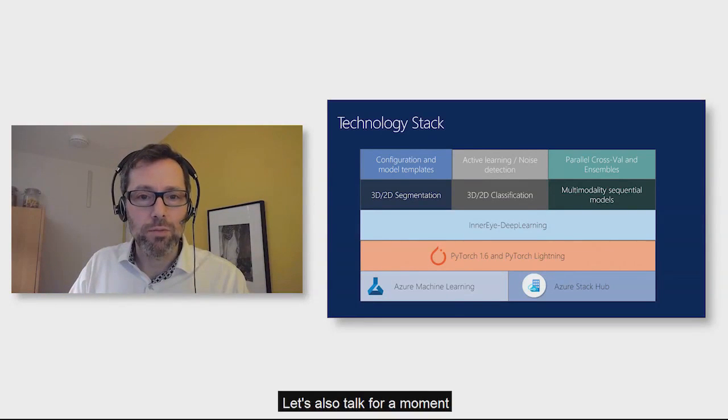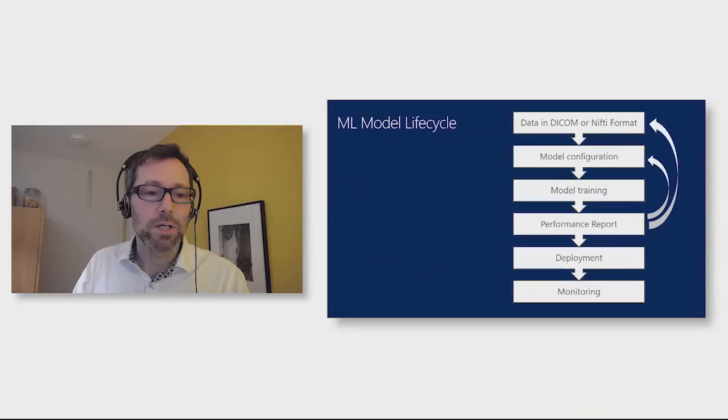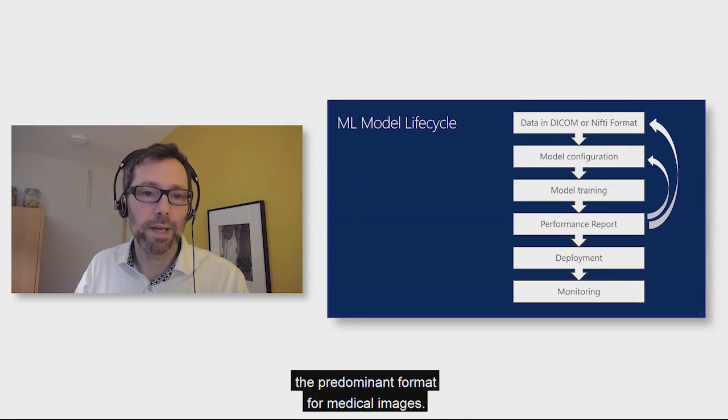Let's also talk for a moment about the machine learning lifecycle, because I'm going to present some steps of that and how they relate to the InnerEye toolbox in a minute. So we would start out here with data in DICOM or NIfTI format. DICOM, of course, being the predominant format for medical images.